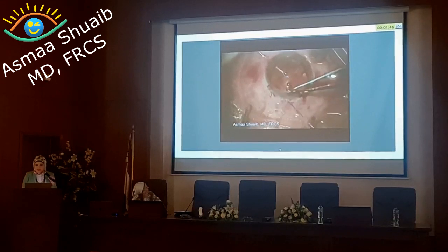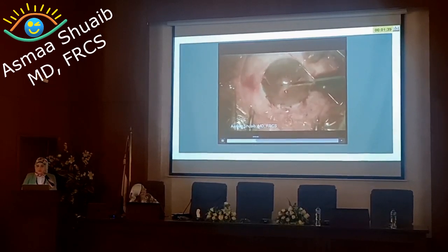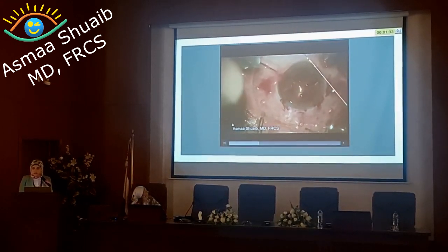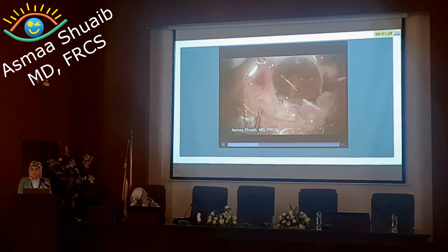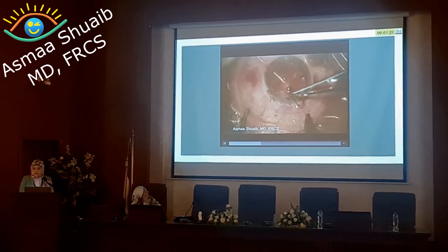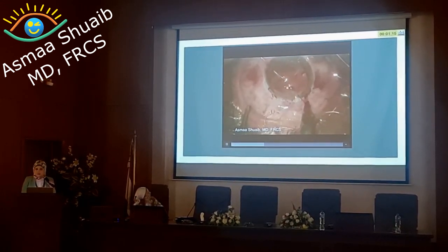In these cases, you will tie the Prolene 10-0 sutures around the haptics, then insert an insulin syringe inside the pocket, at the bed of the pocket, and then get the needle of the 10-0 suture tucked into the insulin syringe.